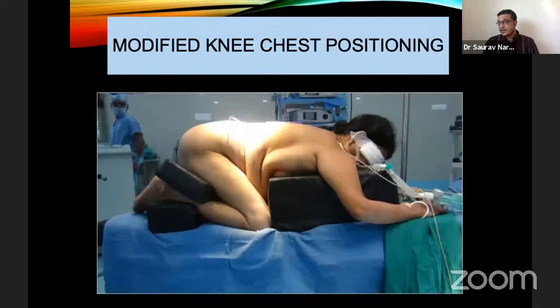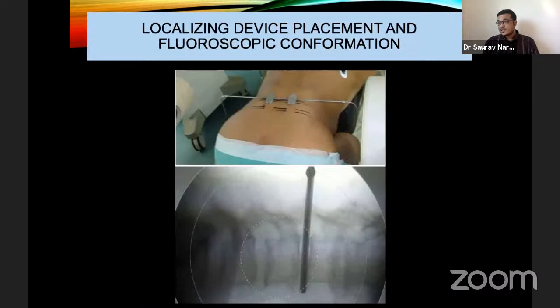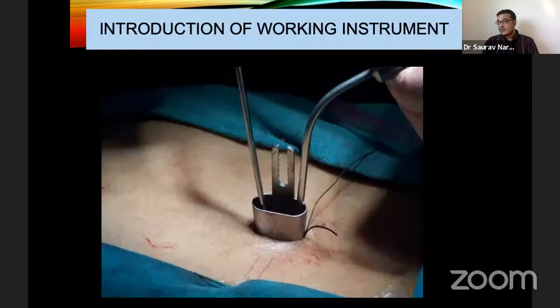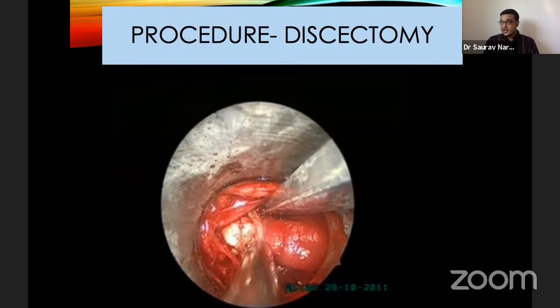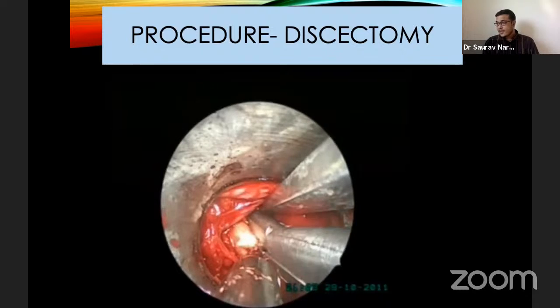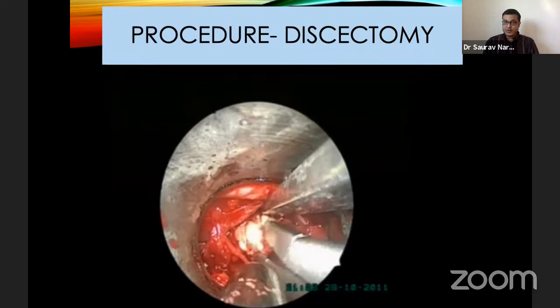All the patients were operated in the knee-chest position after administration of general anesthesia. The localizing device was used to identify and mark the level. A 15 to 20 mm skin incision was given, just 5 mm lateral to the midline, for introduction of the system directed towards the interlaminar space of the affected site. After exposing the protruded disc, it was punctured and the loose disc fragments were removed.